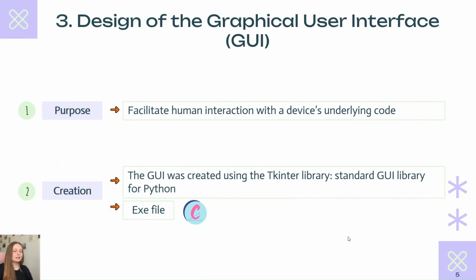Now, regarding the design of the graphical user interface, the purpose of a graphical interface is to facilitate human interaction with a device's underlying code. For creating our graphical interface, we used the Tkinter library, which is the standard library in Python for creating this kind of interface. We also developed an executable file so that the final user could access this graphical interface only by clicking this file and without having to execute the Python code behind it.